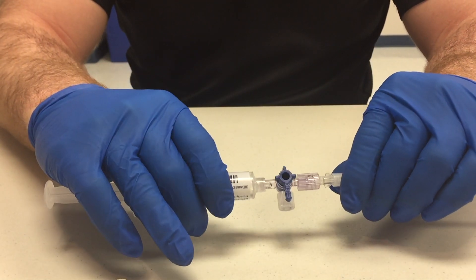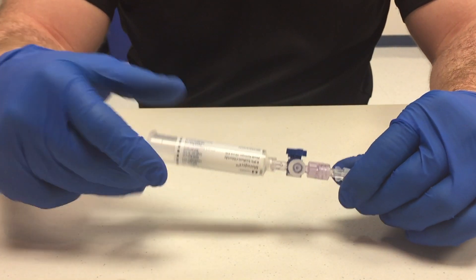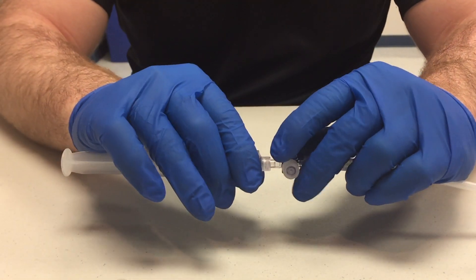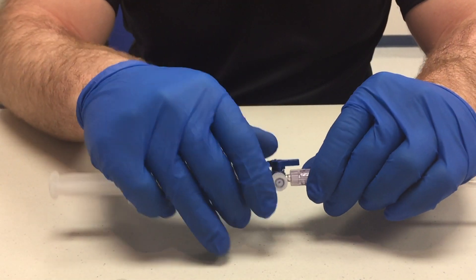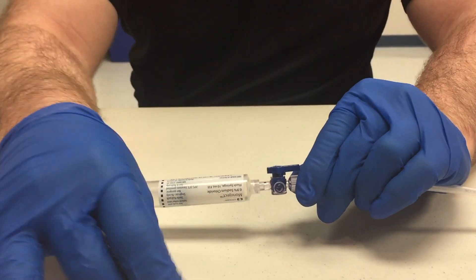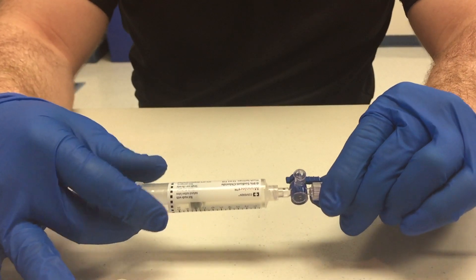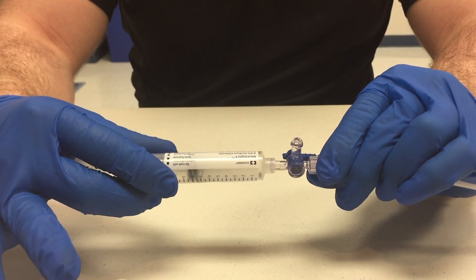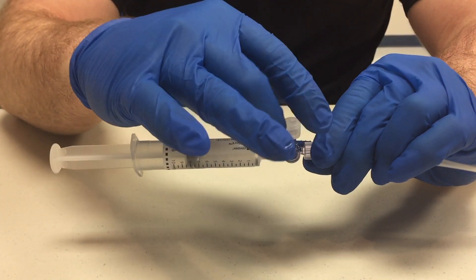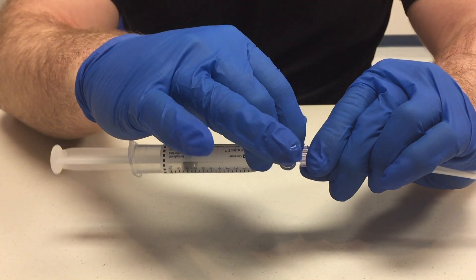This is a very important step because you do not want to induce an air embolism into an infant — this will be a very big mistake, if not fatal, if you induce an air embolism. Take notice how the paramedic clears the med port by making it vertical, flushing saline out to clear all the air, and then recapping the med port.